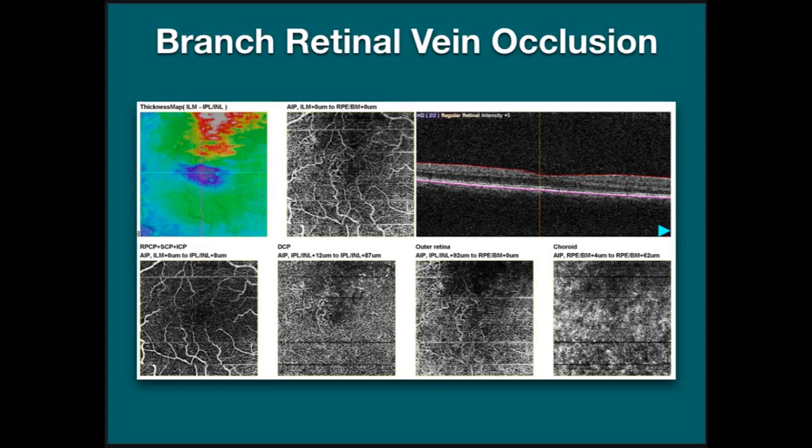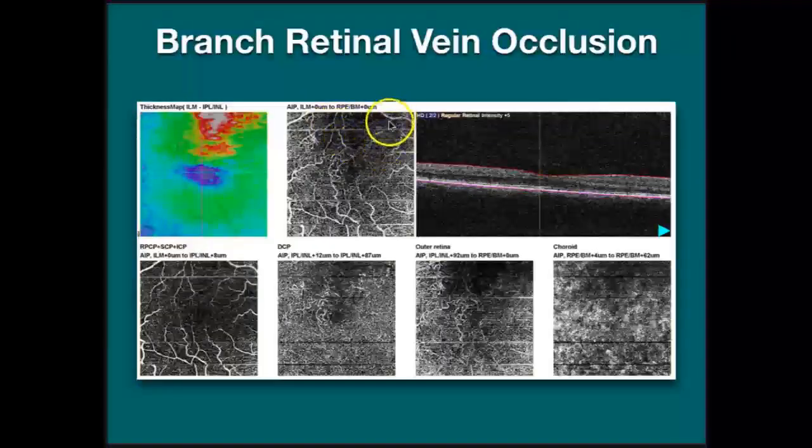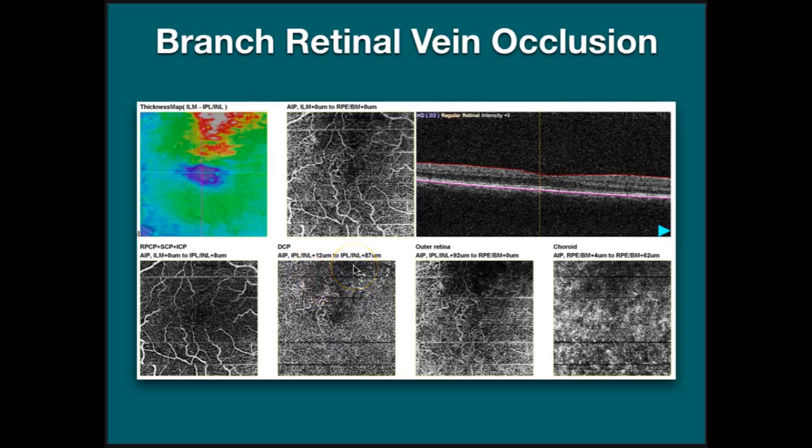patient. So we performed OCT angiography, and we can see that in the full retinal image, which is from the internal limiting membrane right down to the RPE, overall we see good vasculature. We can see the foveolar avascular zone, but there's decreased signal in that upper area. So we have to decide, is this signal loss due to occlusion of the image by blood, or is it actually capillary dropout? If we look at the equivalent angiography underneath, we see some very good capillaries in that area, but a little bit of attenuation in signal up in that area.